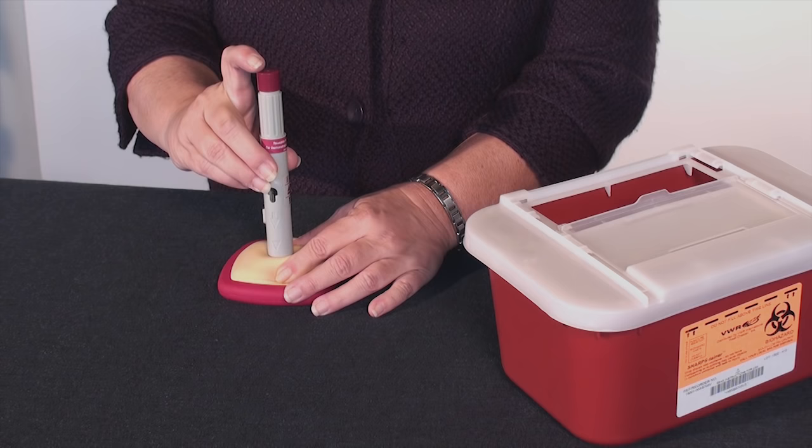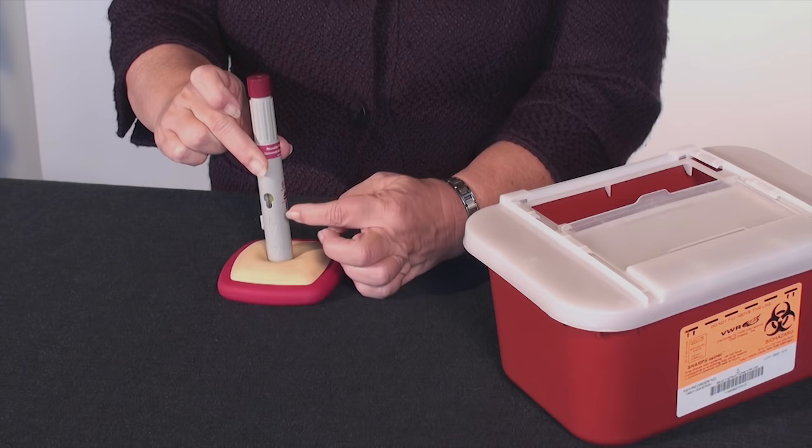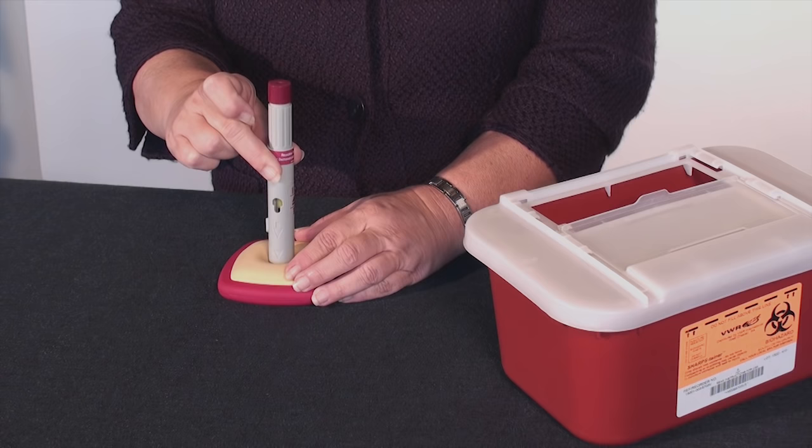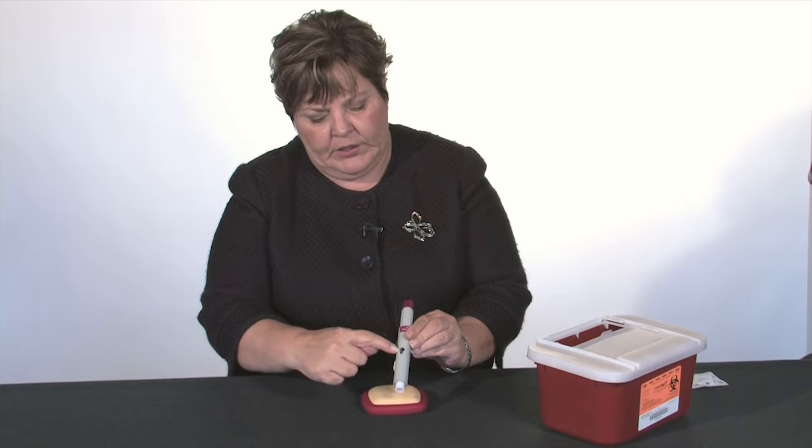So we're going to hold this here and push the button. It's going to make a loud click. We're going to count about 10 seconds, and then we're going to look in our little window. If we see a yellow indicator, we know that the medication has been injected.